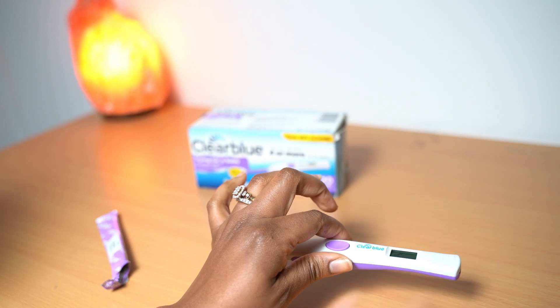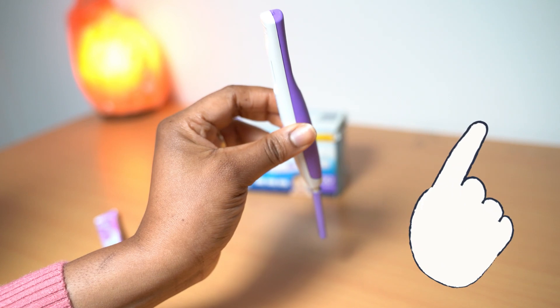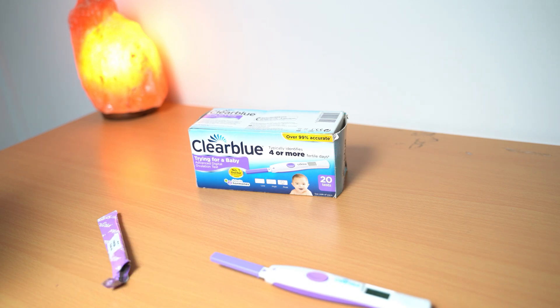And you leave it on a flat surface. Please, you're not meant to leave it like this or like this — you're meant to leave it on a flat surface, then it's going to read the test.